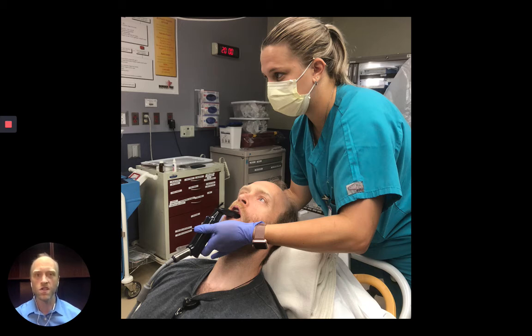So you want to position the patient in a semi-recumbent position with the intubator toward the head of the bed just to the patient's left. As you enter the oral cavity with the VL blade, try to avoid touching any soft tissue until you have your blade tip in the vallecula.